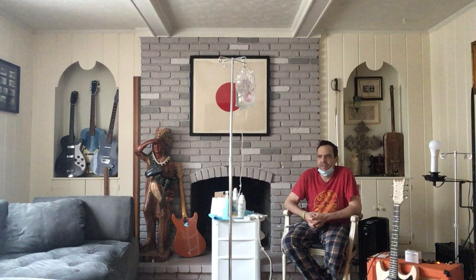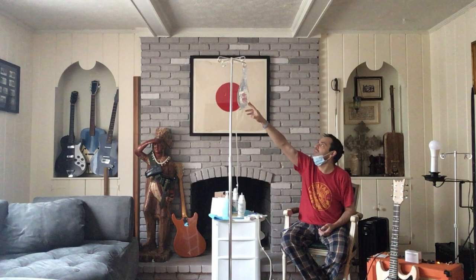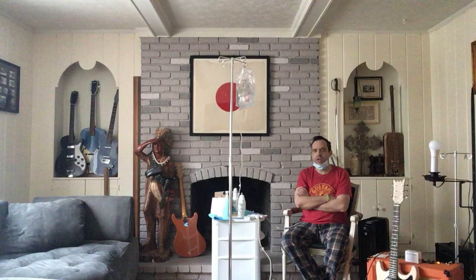So, beer bonging 3,000 milliliters of dextrose. And we will probably get out a little bit more than that. We'll probably get out like 3,200. For a while I was getting 3,700, 3,800. Then they switched me to a lower solution.